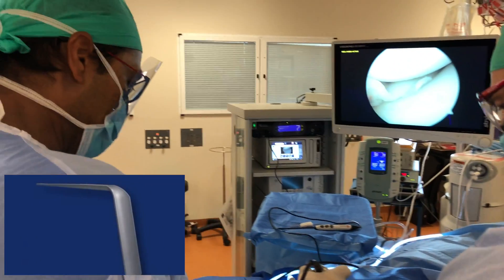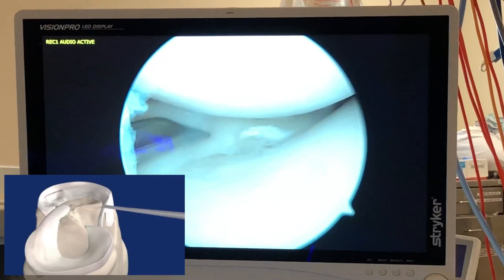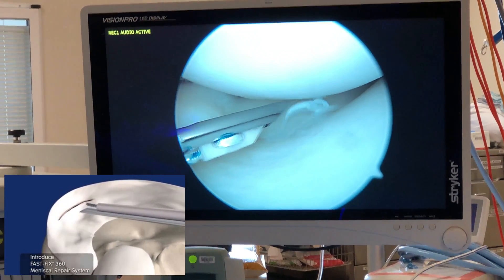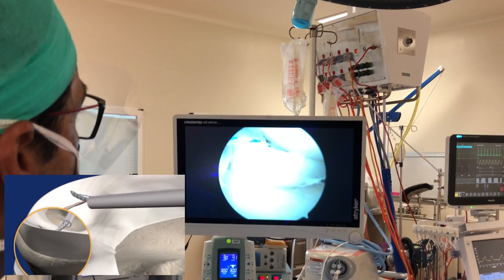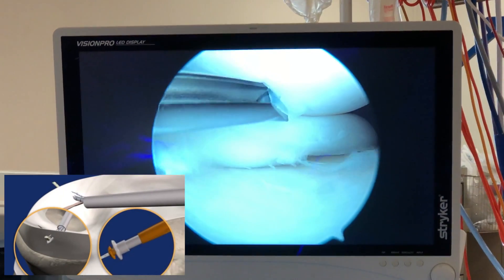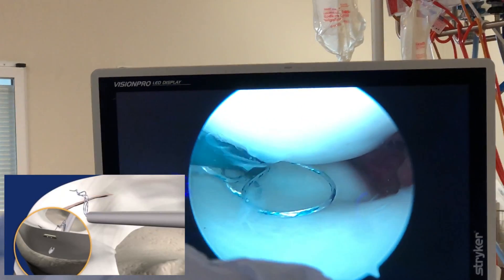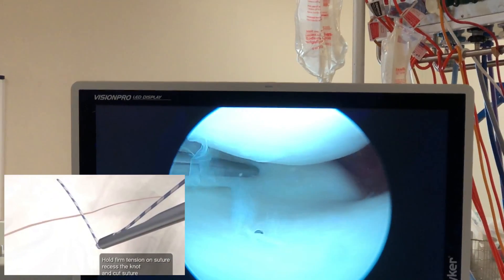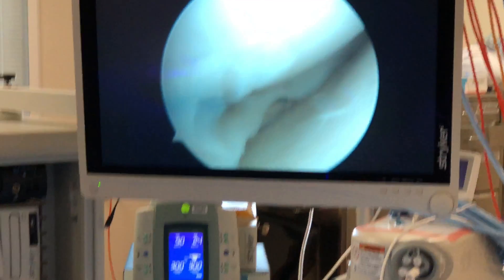This is a guiding trocar that we put in, and you can see it's going to come up into the knee in a secondary portal. Here we are, putting it next to the meniscus. You can see those little anchors in there. We're going to put one in the side and the next one we'll put at this angle here — same process, we put the guide in there.